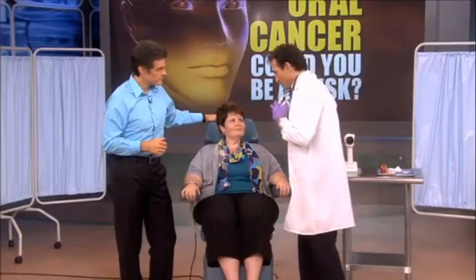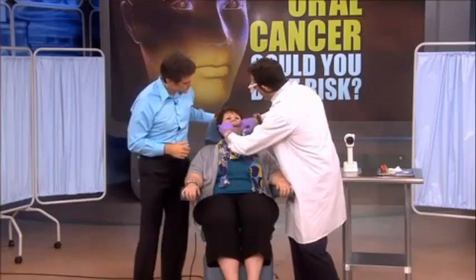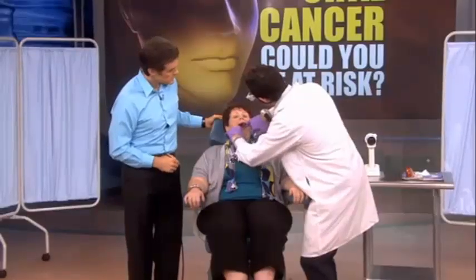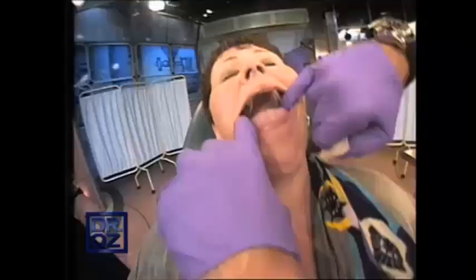But before you show me the velscope, can you just show us what an exam looks like fundamentally? Okay. So a normal examination, we really want to look at all of the soft tissues in the mouth. So I'm going to put my loupes on. Please put your head back a little bit. Open for me. And we're looking at the lips. We're looking at the oral and buccal mucosa. Open real big. We're looking at the cheeks. We're looking at the oropharyngeal area, the tonsil area, all the way in the back, right?